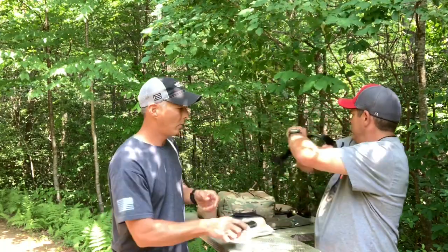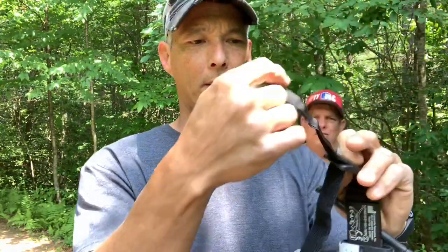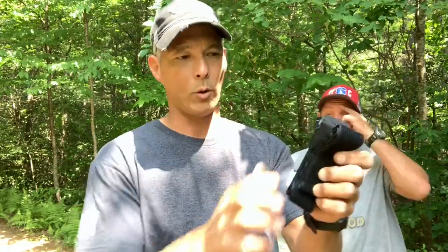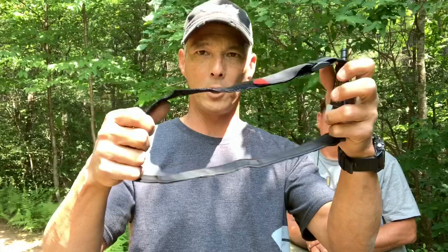One of the things I wanted to mention is that when you get a CAT tourniquet, it doesn't come the way that he had it set up. One of the first things we do is take a CAT tourniquet like this and restring the loop here so you have the biggest opening. A lot of people don't like it that way because it's not as compact and neat looking, where it kind of sits on itself. But if you've got to do it quickly, or put one on yourself or on your leg, you want the biggest loop you can find.